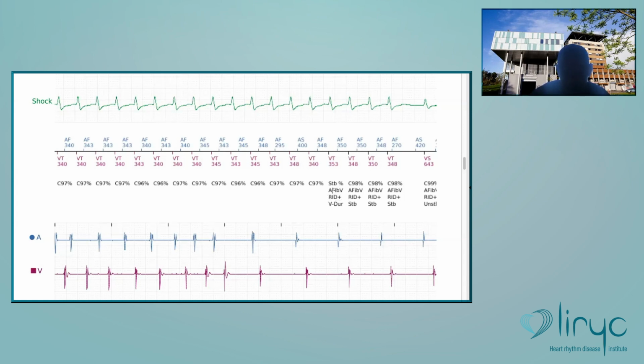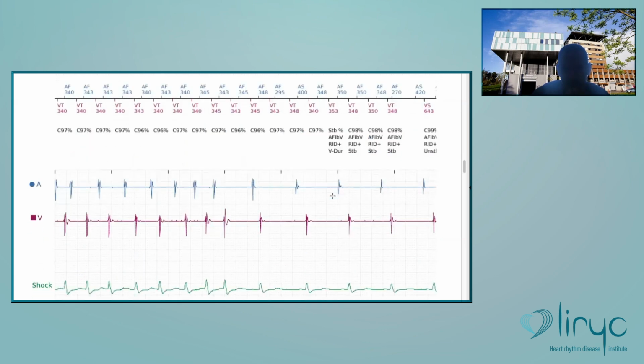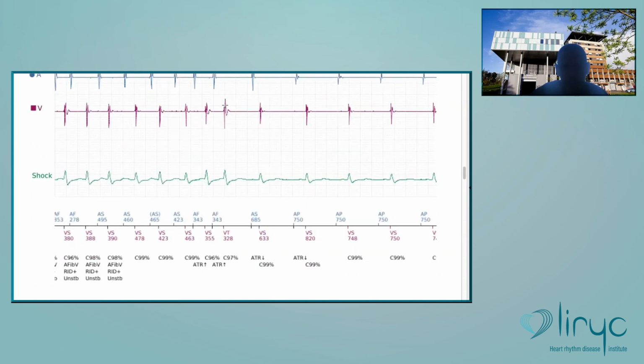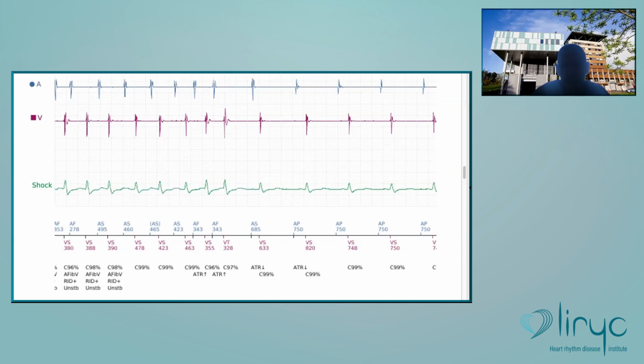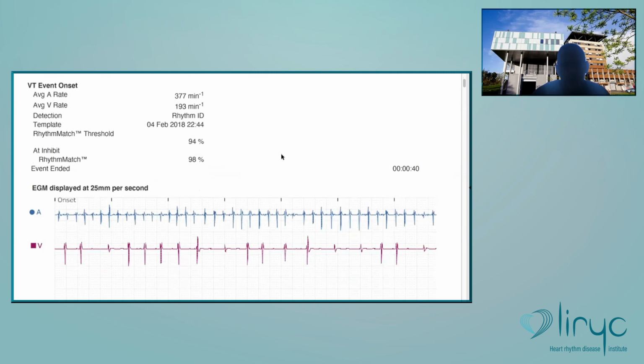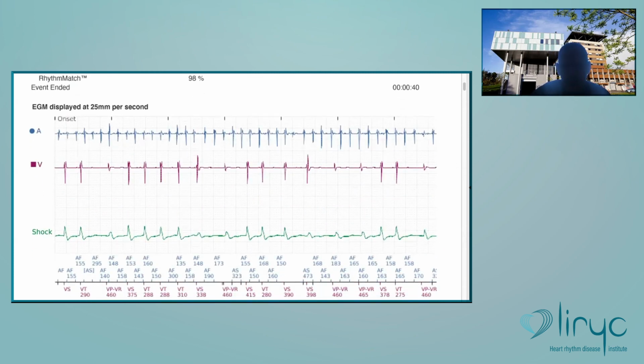There is a correlation, therefore no therapy is delivered. You see the way it stops spontaneously, it stops on a ventricle, so it is also a point for the diagnosis of atrial tachycardia compared to ventricular tachycardia. Any question? The same for atrial fibrillation, so I will not spend too much time.